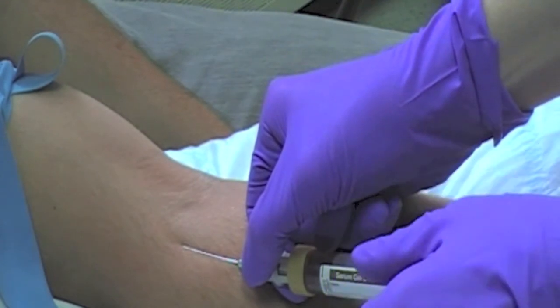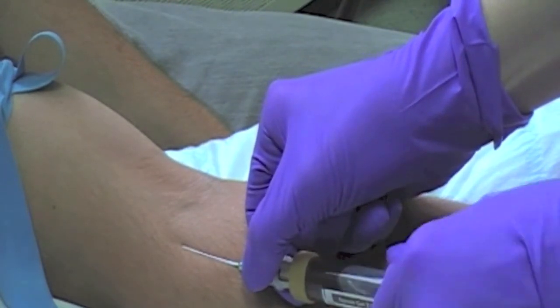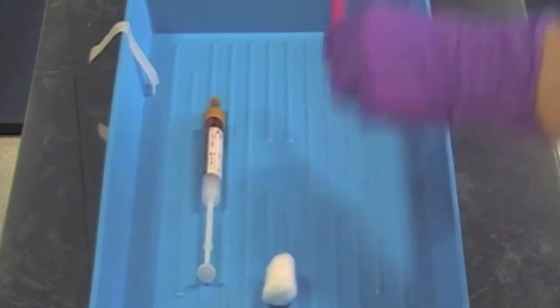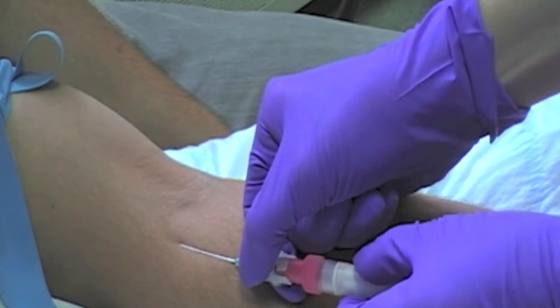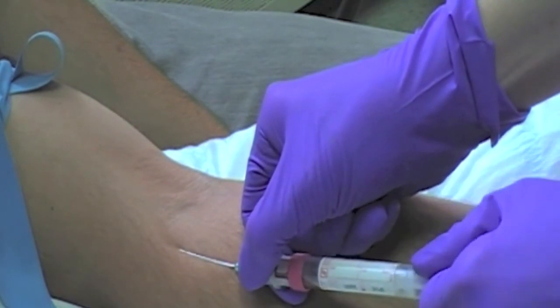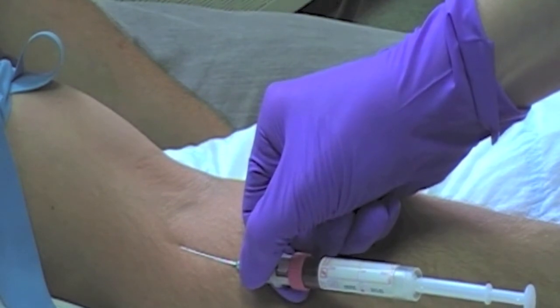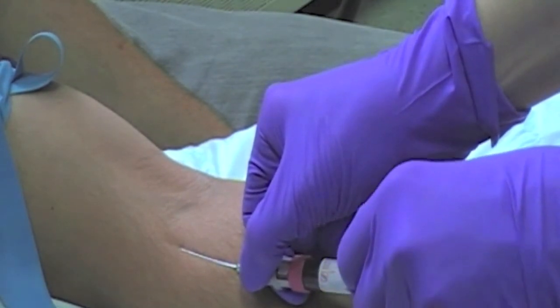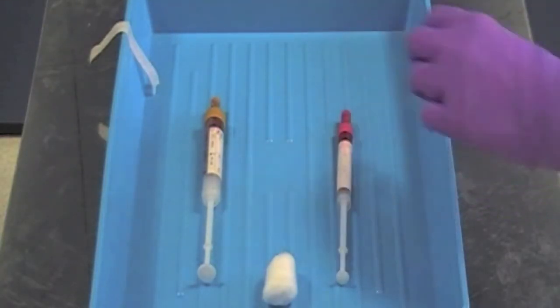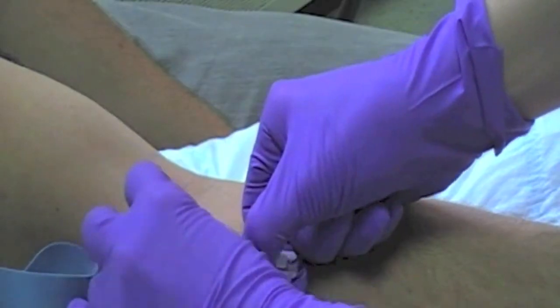If you require further blood samples, turn the sample bottle anti-clockwise and separate from the needle. Invert the bottle gently and place in your tray. Attach the second and subsequent blood sample bottles to the needle — it is important that you hold the hub of the needle firmly during the changing of the bottles. Once you have filled all the required blood sample bottles, remove the last one from the needle and release your tourniquet. Without pressure, apply the cotton wool swab to the puncture site.